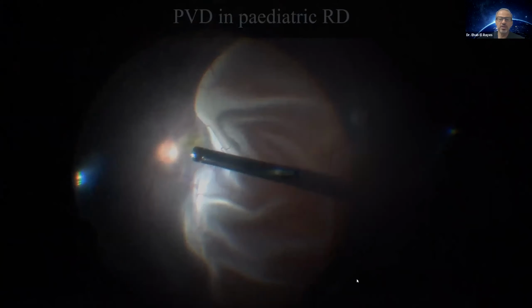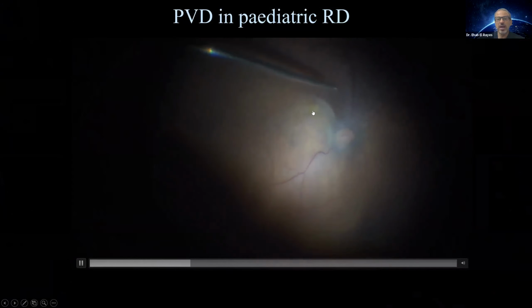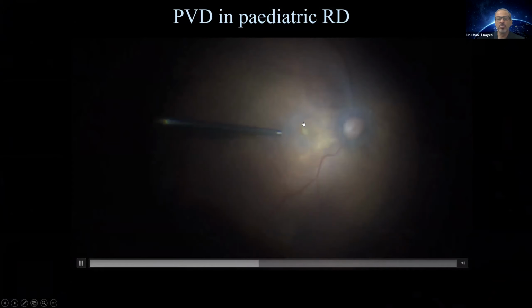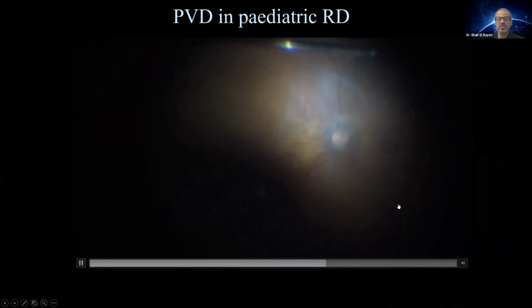Tears can happen easily around the arcades or at the equator. Not just at the equator, but sometimes, like in this patient, he has very tight adhesion to the retinal surface. Notice what happened in the foveal area here while detaching the hyaloid. You drop an operculum right here because you aren't looking at the correct plane, and you can see the amount of traction that is exerted.